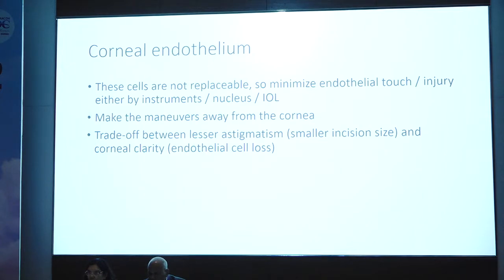And finally, in all the techniques, one thing always to be looked at is the corneal endothelium. These cells are not replaceable, so we minimize endothelial touch or endothelial injury either by the instruments, by nucleus, or by IOLs.